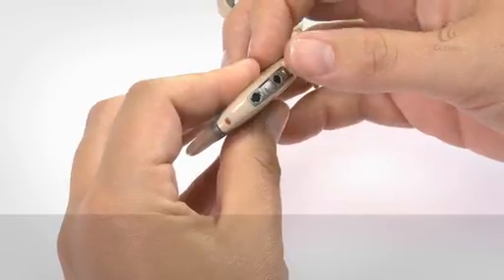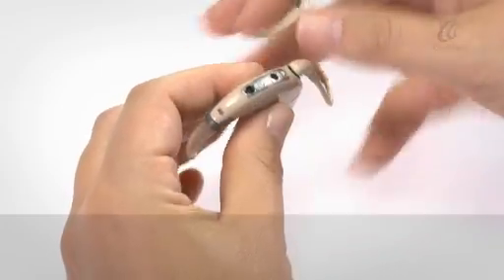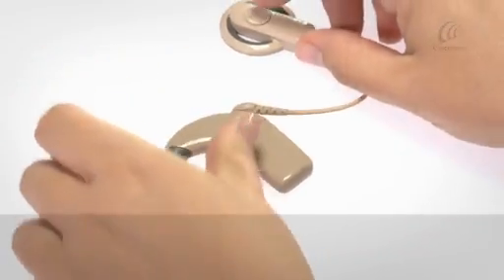To turn off, press and hold the lower button for two seconds. The processor will flash steady orange as it turns off.